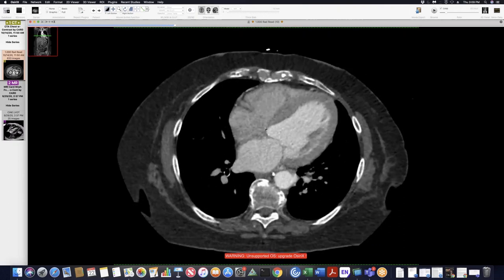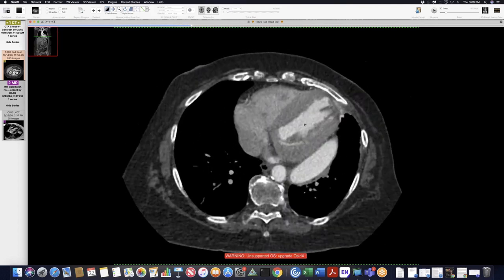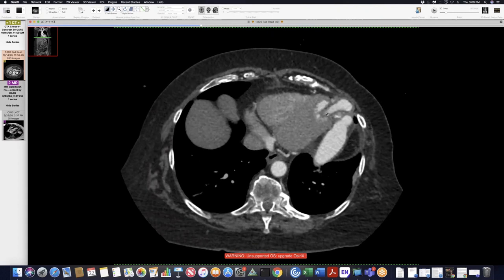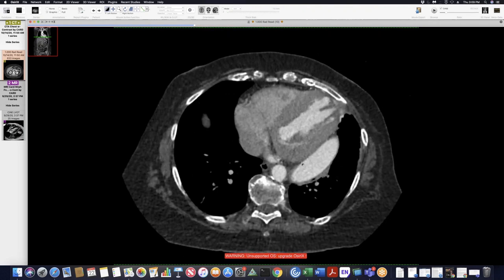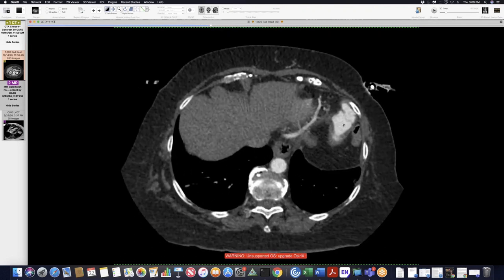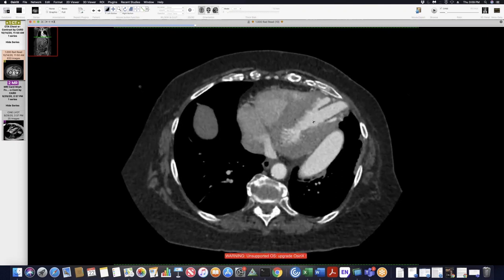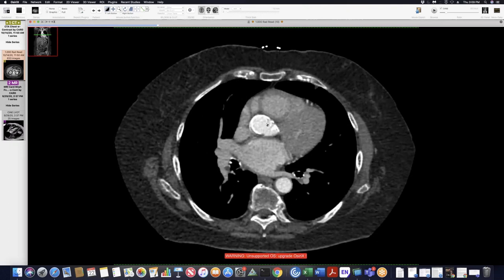So at the time, the surgeon had one of these conduits available. They're made by Medtronic. They're called apico-aortic conduits, and it's essentially a conduit that you connect from the LV apex, as you can see here, and it just gets attached to the descending aorta, and it has a little valve right there. It's a little bioprosthetic valve, and so basically the purpose of this is just to take off some of the pressure gradient that's really high here across the aortic valve.